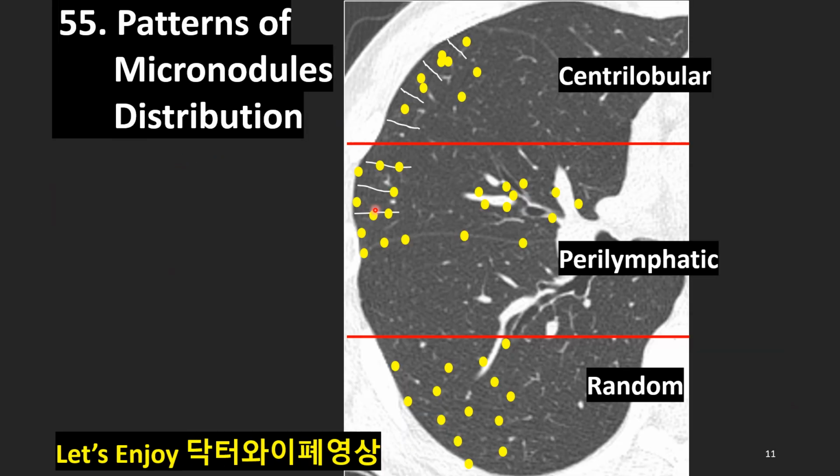This slide is actually the most important slide among this lecture. The white line is interlobular septum. I made this one. I myself made this slide.